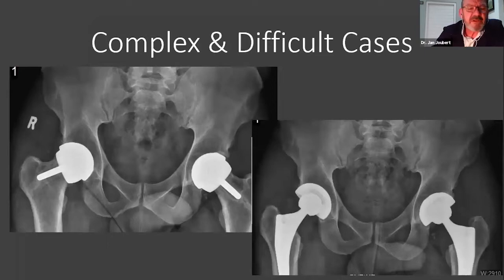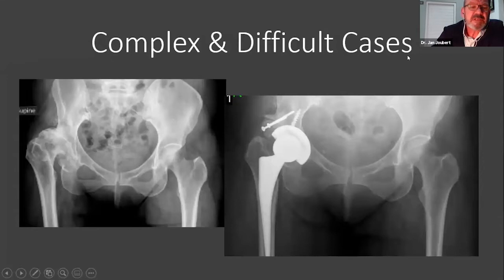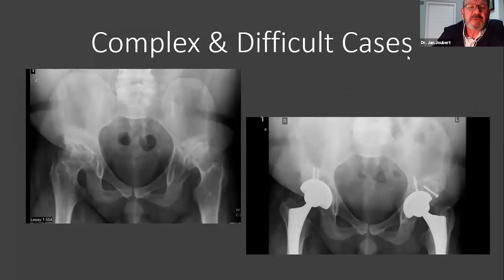Bilateral resurfacings, we've done a lot of resurfacings, revisions, and you effect a very stable and reproducible positioning of the implant. This 31-year-old gentleman has subsequently done two or three epics after his revisions. These were severe dysplastic hips, and interestingly, in this case, we also used this 3D technology to determine the exact size and shape of our implants, and we managed to do this without much difficulty. This case was a virtually ankylosed hip, and we used a part of the femoral head to reconstitute the acetabulum and the center of rotation of this hip.